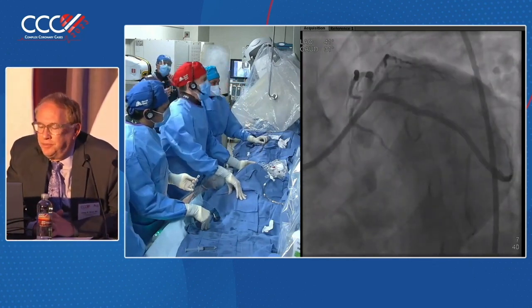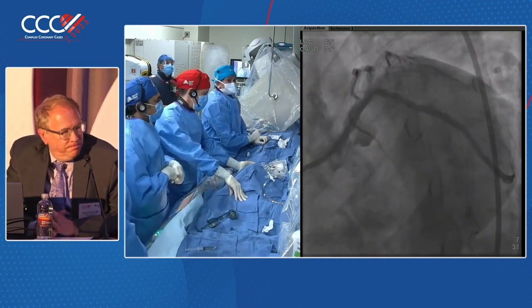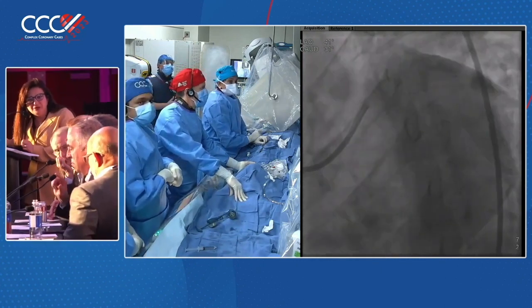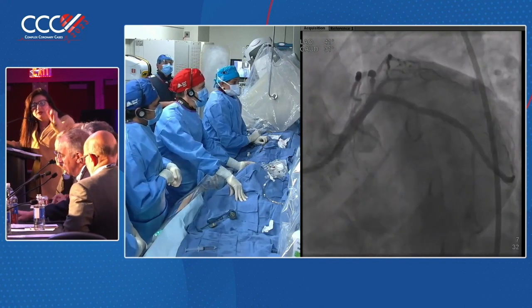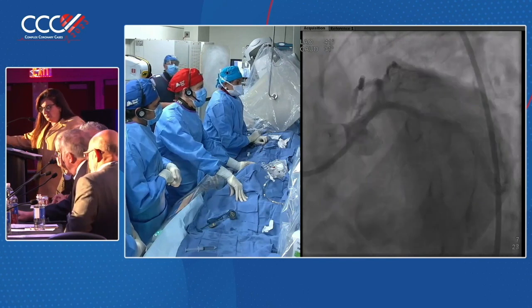So let's talk about technique. Let's start with Dr. Lasala. What do you think here? I mean, it's not that simple, I don't think, but maybe Dr. Kinney will make it quite simple. You have to keep pressing on the button as you speak. Keep pressing. Okay, you got it.